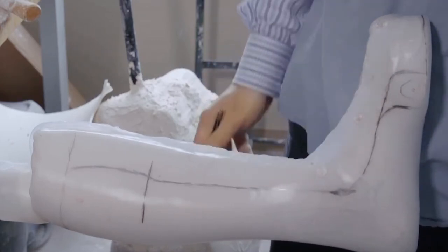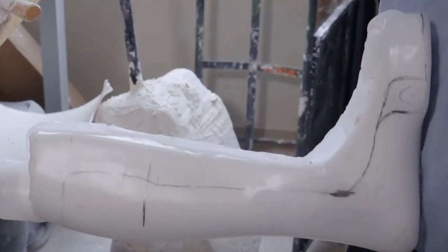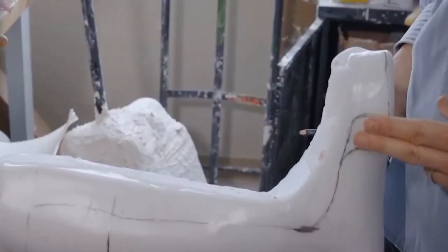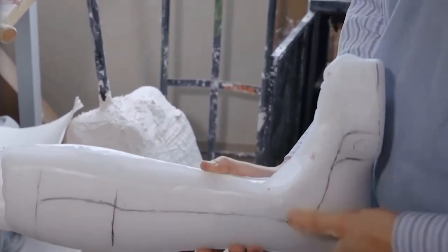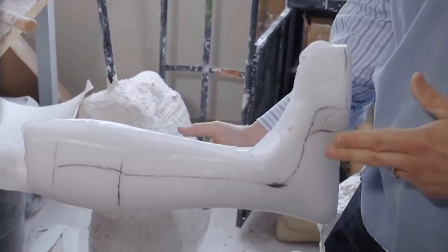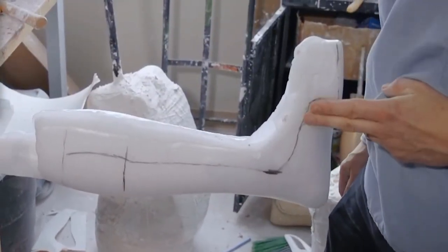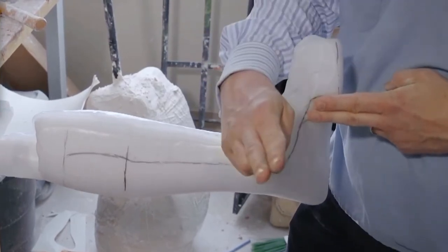And the reason why is if a person in-toes, they might have foot drop, but they might also bring their foot in and it hits the other foot when they walk. So we need to stop it from coming in. And if you can imagine, my hands are trying to stop it every step the person takes. So if I was going to do that, I would need something here to stop the in-toeing, because this is the left foot. We don't want the toe going in.